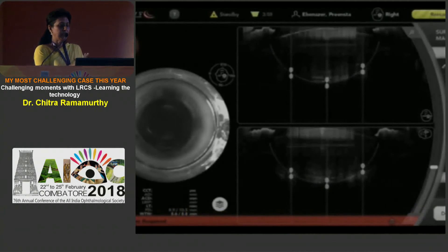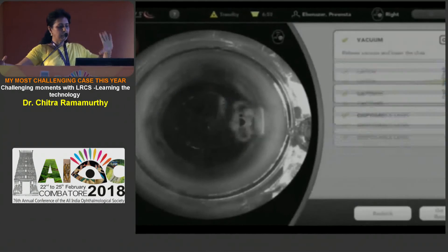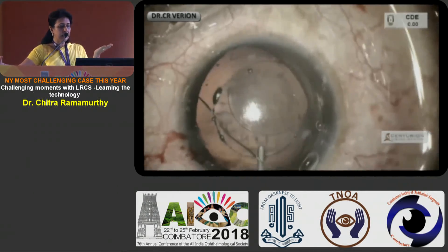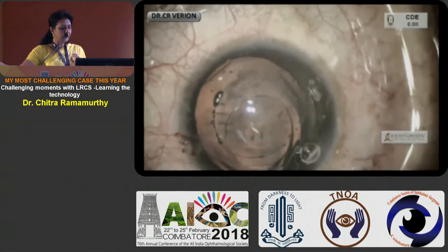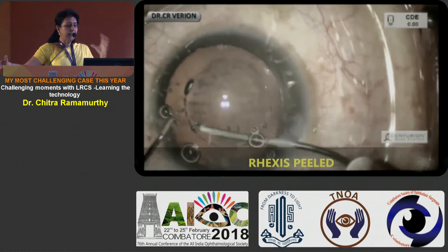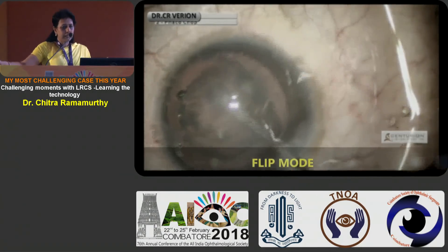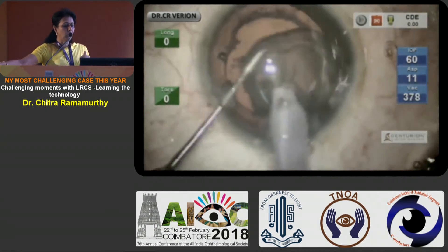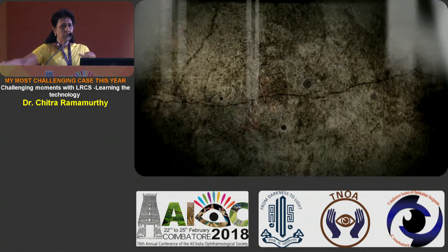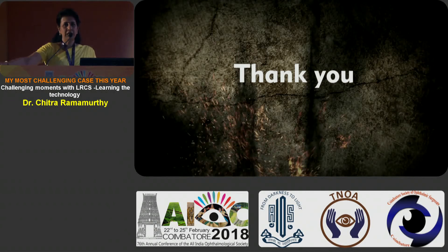This was another case where an ICL was already in the eye and the patient had a cataract. I had to increase the anterior capsular offset and the posterior capsular offset, because there are going to be a lot of cavitation bubbles which cannot regress with the ICL sitting in the eye. I decreased the vertical spots so that fewer cavitation bubbles are created. I then nudged the ICL out of the bag with a hand-over-hand technique. You can see there's a cut on the ICL — in spite of increasing the offsets, a cut had occurred. I was unsure whether the rhexis had been fully cut, but thankfully it was. This was a very soft cataract, so I go on to the flip mode and remove the entire cataract, remove the cortex gently, and then position the lens. Essentially each of these cases was a problematic case in itself, but each of these small clues helped me bail myself out of these challenging moments. Thank you.